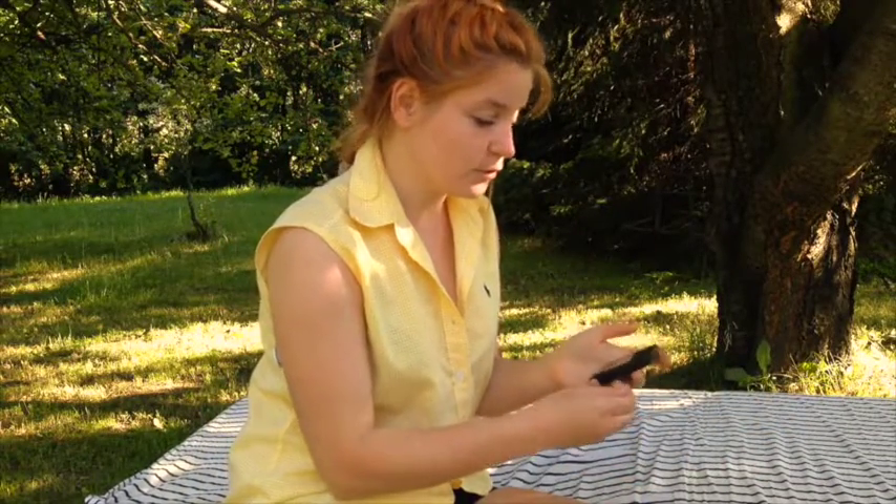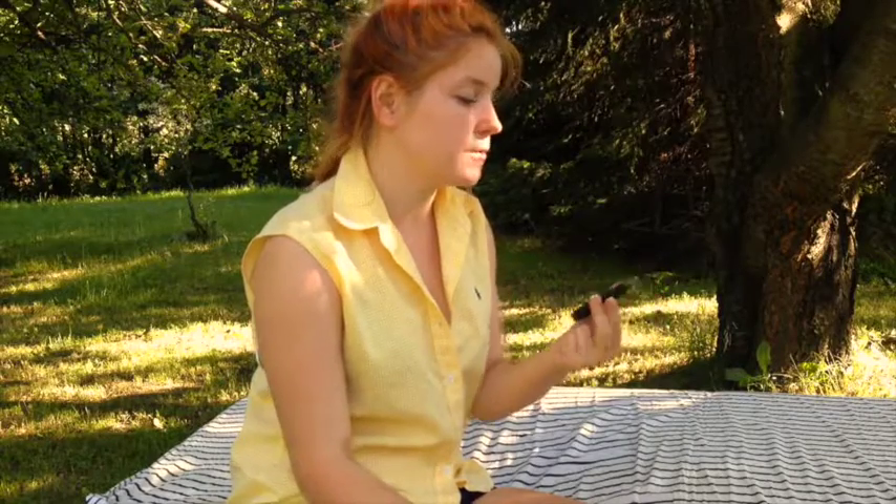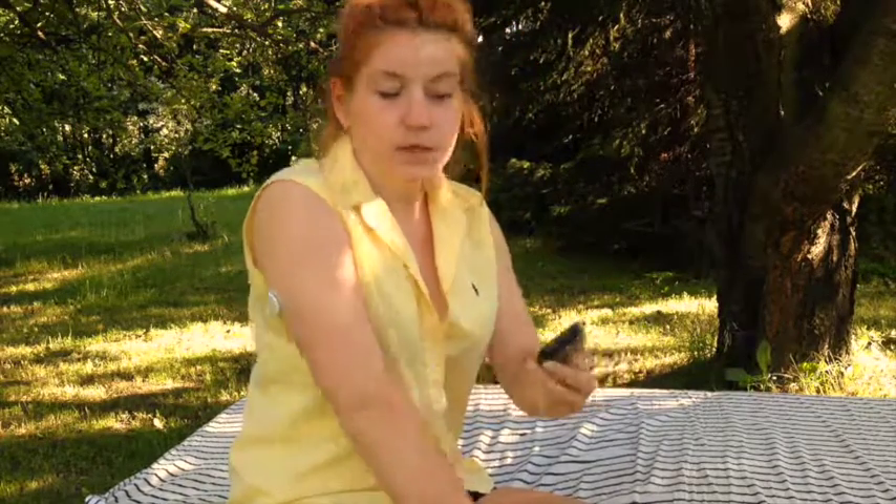No dobrze, glukometr jest już gotowy do tego, żeby sprawdzić cukier. Wystarczy tylko przy sensori nacisnąć jeden przycisk — on od razu pokazuje informację: Sprawdź stężenie glukozy. Zeskanuj czujnik, aby sprawdzić stężenie.